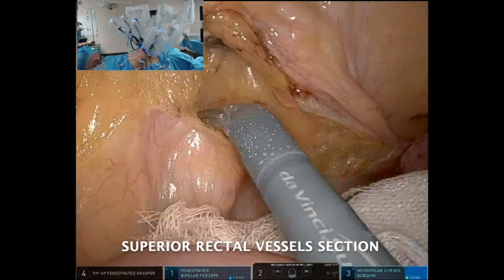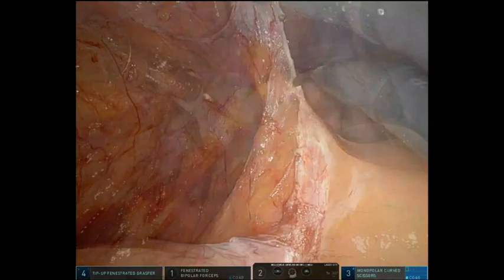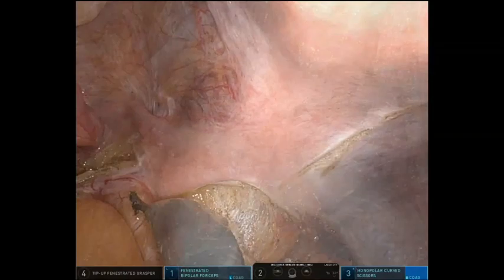The right pararectal peritoneum is incised up to the dissection of the superior rectal vessels, which are then sectioned. The mesorectum is dissected along the mesorectal fascia with direct vision and preservation of both hypogastric trunks. The dissection is performed starting in the posterior part, up to the lower pelvis, and continuing along both sides and the anterior parts as far as the levator ani plane.